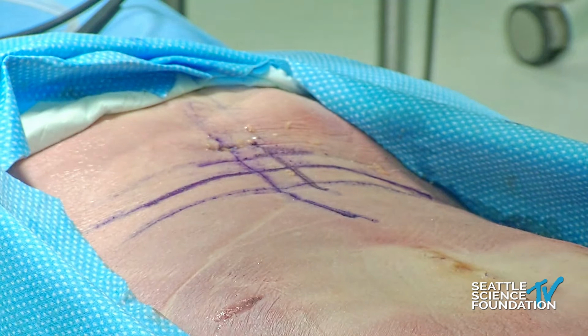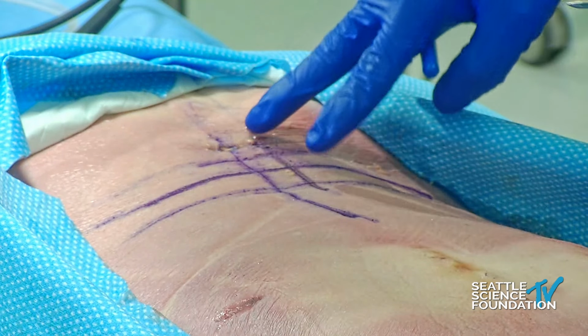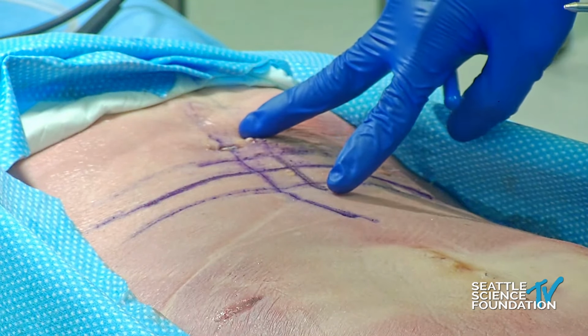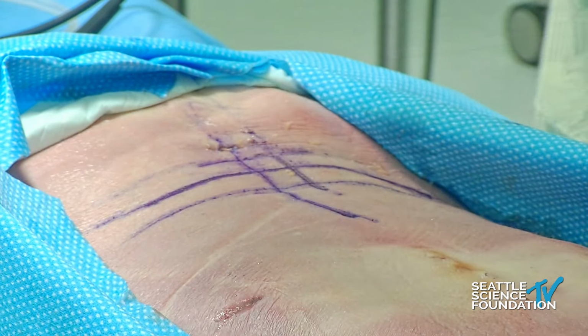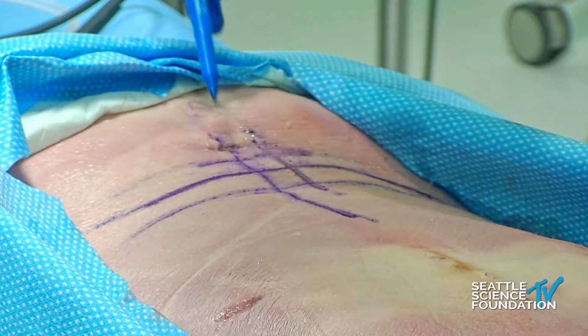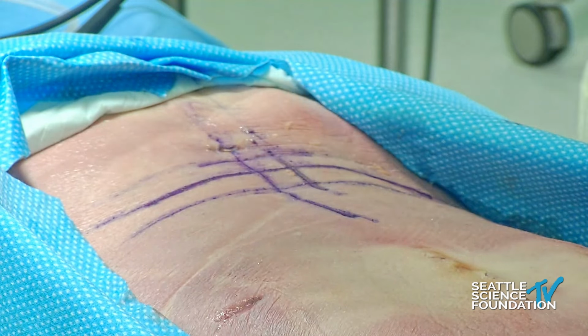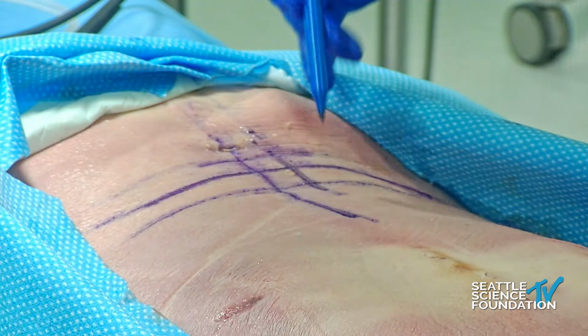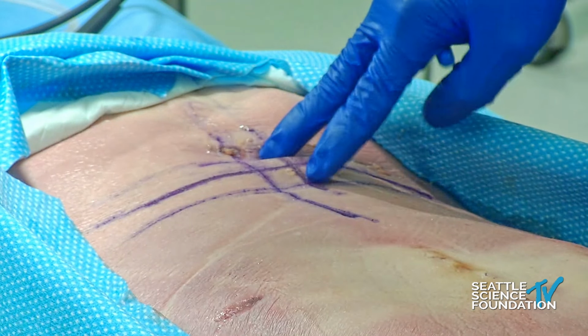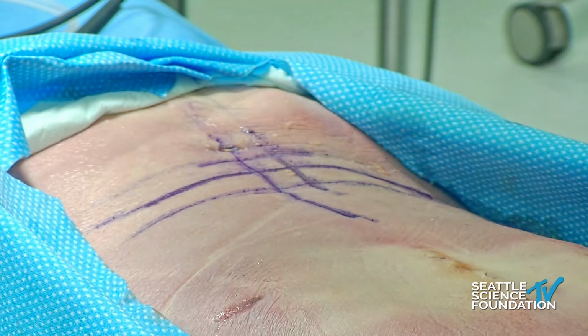Same thing with the cranial. If I'm doing a very obese patient or a very large patient, you can imagine that the L4-5 pedicle is going to be further apart. Now, the important thing is that this is based on these studies from Korea, that you don't want these two incisions to be larger than 5 centimeters apart. Because if you have a lot of soft tissue in the middle and you're triangulating very deep, then you're going to kind of struggle.